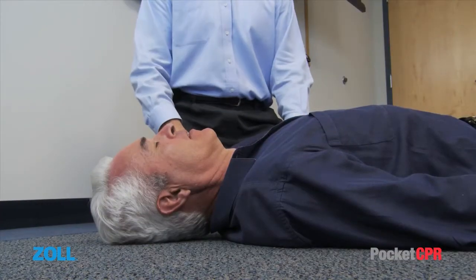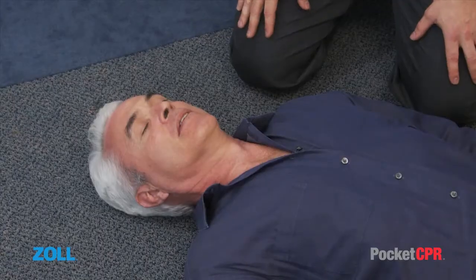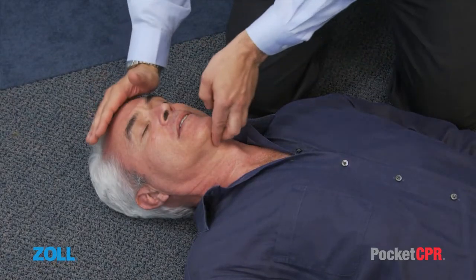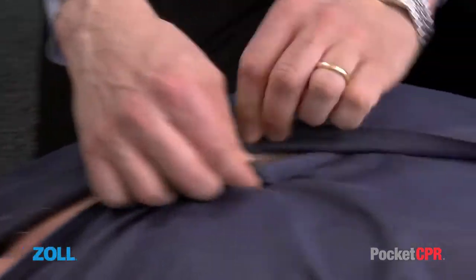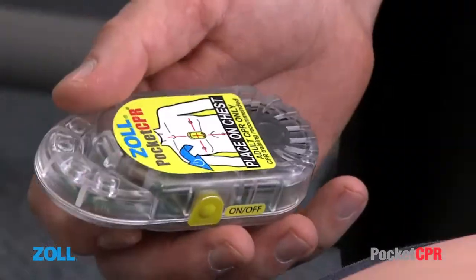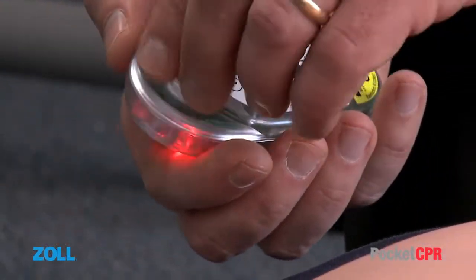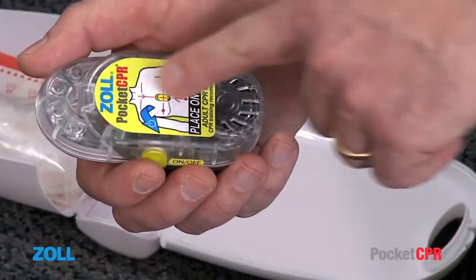Now open the airway. Use the head tilt, chin lift technique to open the victim's airway. Open any buttons that would get in the way of compressions. Start CPR. Peel off the adhesive backing and place the device on the center of the patient's chest, following the diagram on the label.